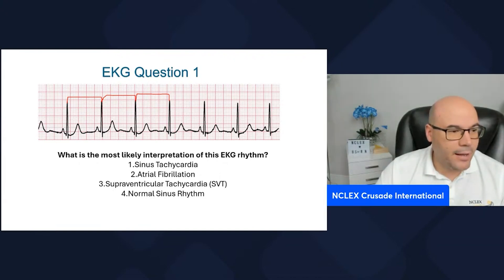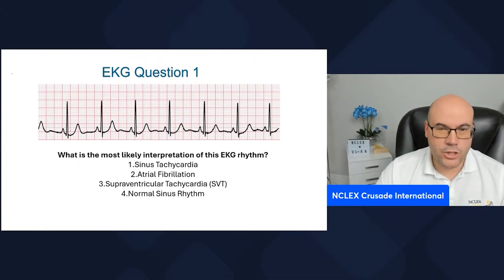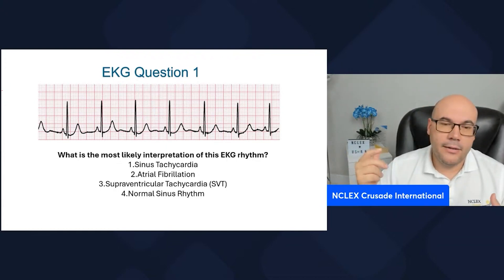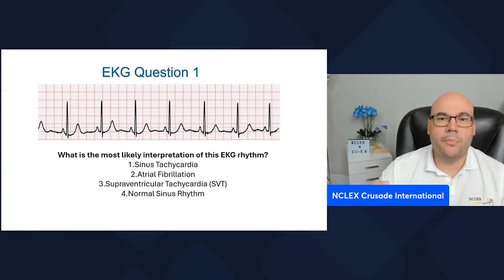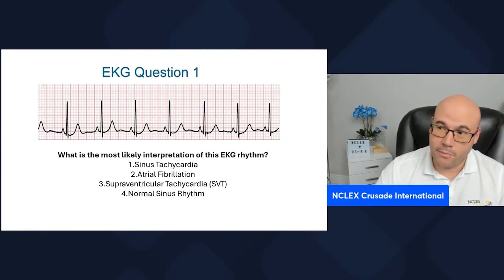Now let's identify the heart rate in this strip, where we're facing a regular rhythm. I'll use the simple method — method number one — which is identifying the QRS complexes in the strip and multiplying by 10. But first, we need to confirm this is a six-second strip by counting the big squares; we need 30 big squares.